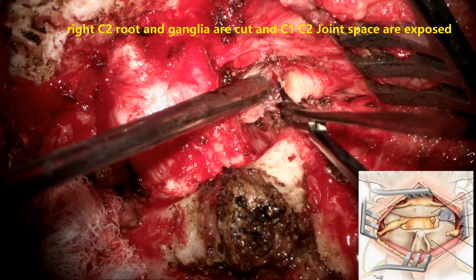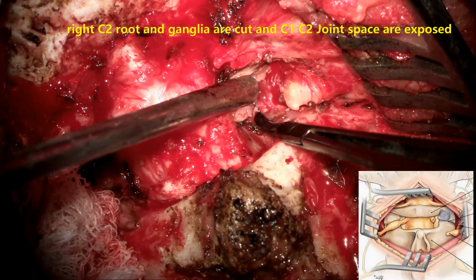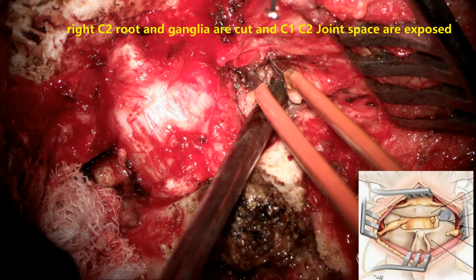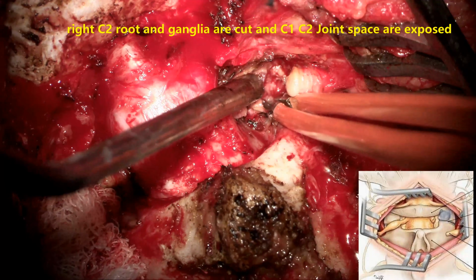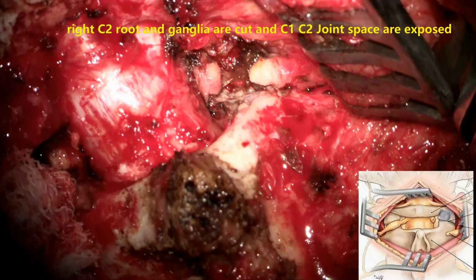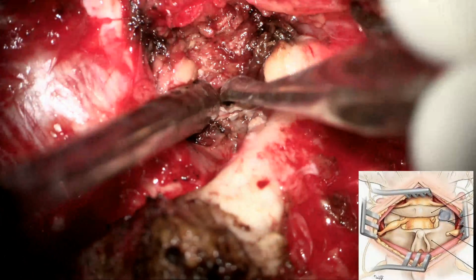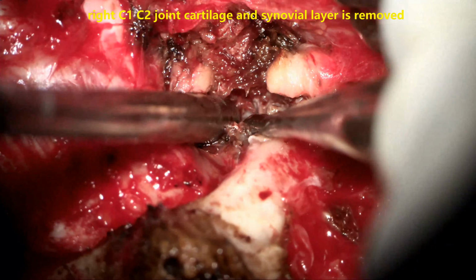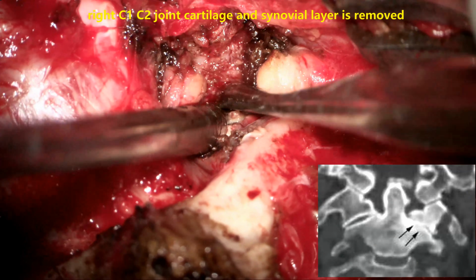That is the fibrous tissue and extradural veins. You can see the dilated, wider veins. Always they are seen at this location. If you don't coagulate, we may end up losing a lot of blood and the patient may need a blood transfusion. A little time and meticulous hemostasis will help in preventing this. Now you can see the joint space is widely opened there, and the joint space is prepared.